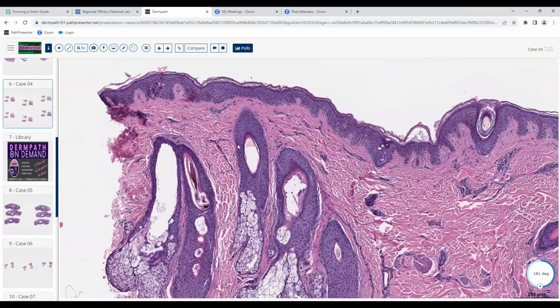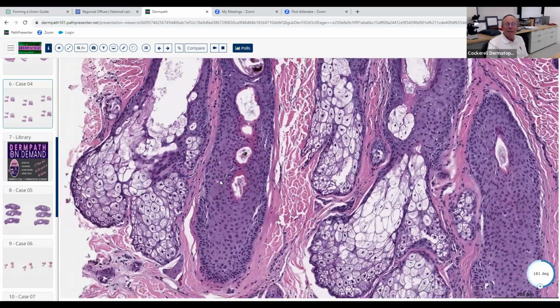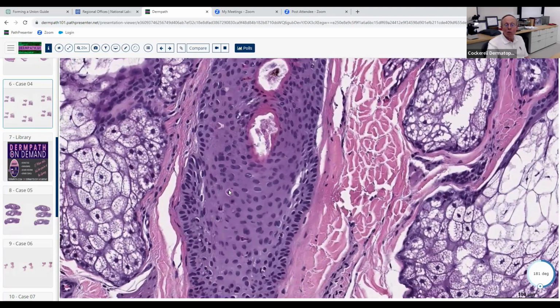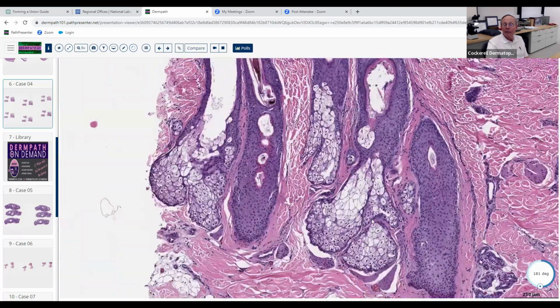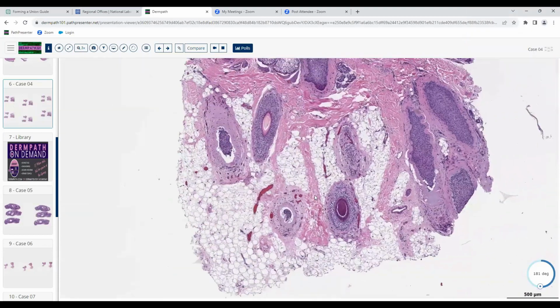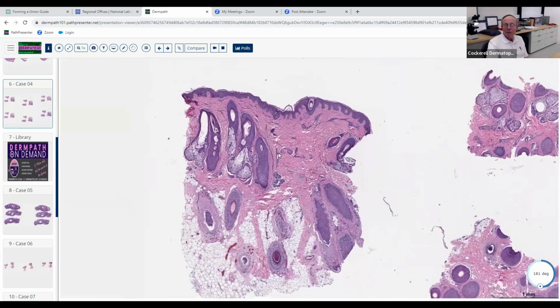And that we showed before. So look at this. This is all damaged, twisted, destroyed. And then you've got catagen. Whenever you see necrotic dyskeratotic keratinocytes in a hair follicular epithelium, that means the follicle is in catagen. So that's been shifted into catagen because of trauma. So what's the diagnosis here? Trichotillomania. Yeah, trichotillomania. Good. Classic.